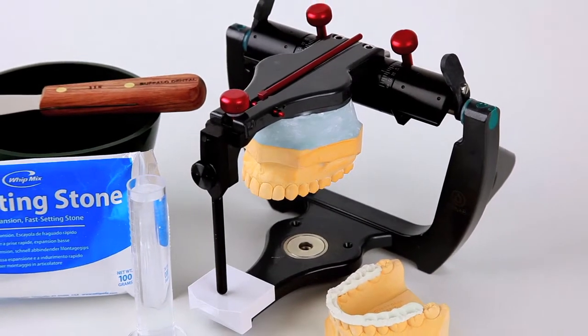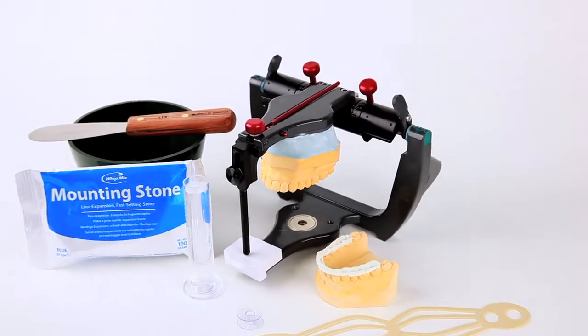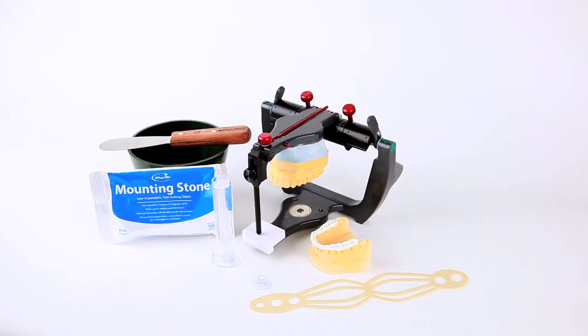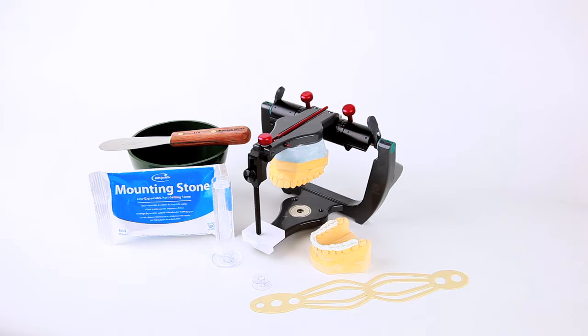This demonstration video is designed to show the proper use and advantages of the flexi-mount stabilization system when mounting casts to an articulator without a thumb screw by using a mounting button on the top arm of the articulator. This demonstration also shows mounting of the casts with a bite registration.